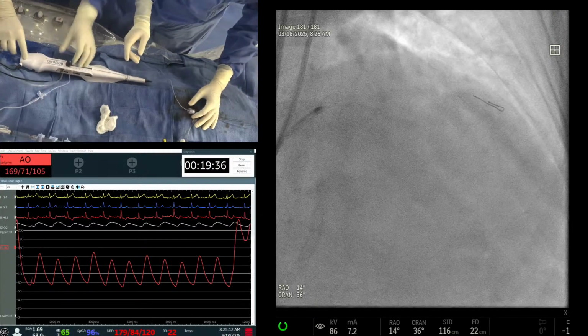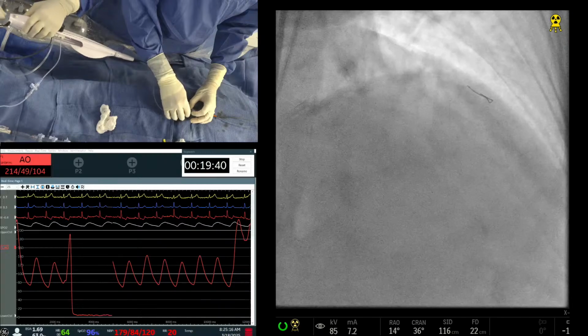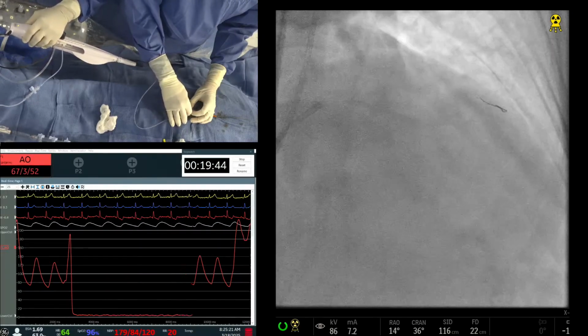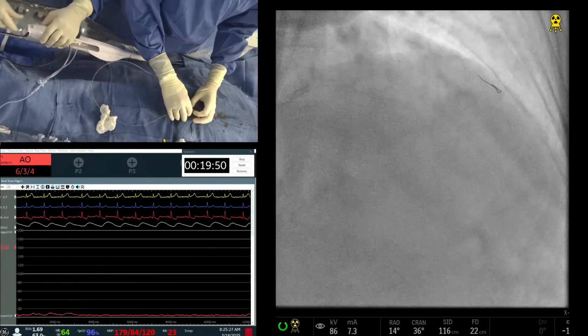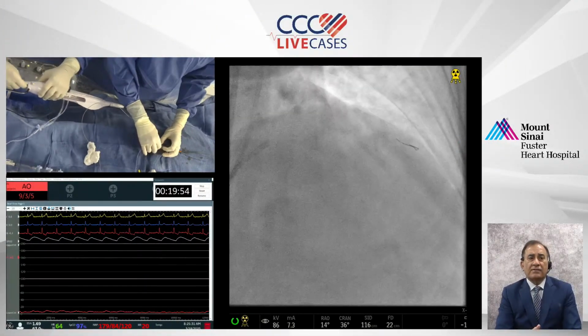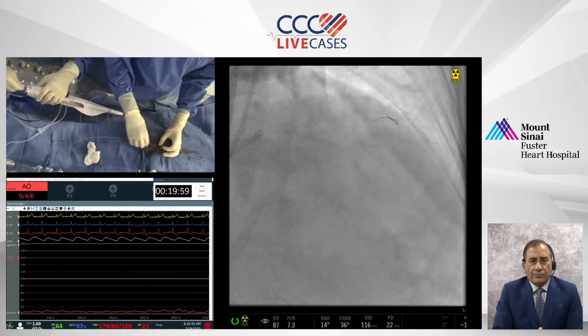Okay, come out. Excellent. And this was done without increasing to 160, ideal run-through wire. This was done at 150. So 152. What made you convinced that you could safely proceed with it? Because there was not a drop in RPM.